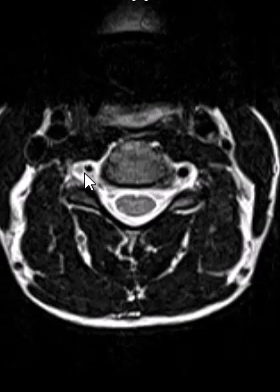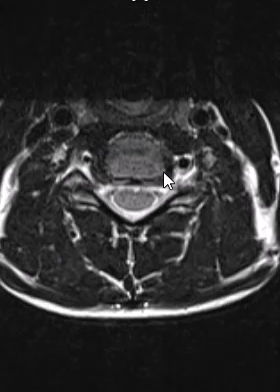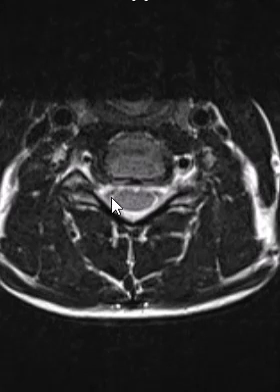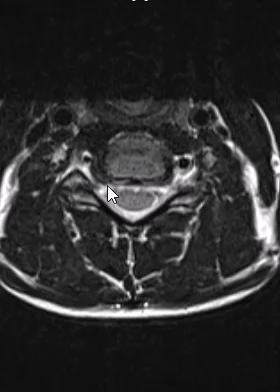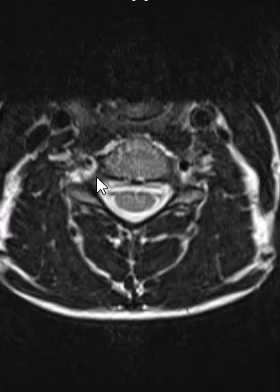Finally, we find the abnormal disc level. At the normal level we see a nice wide-open foramen, but going down to the abnormal level we see the disc and the spinal cord with less fluid surrounding it. Instead of a big wide foramen, disc material is going into the foramen leaving no room for the nerve — it's being pinched in the right foramen at the C5-6 level. That is how to read an MRI of the cervical spine.